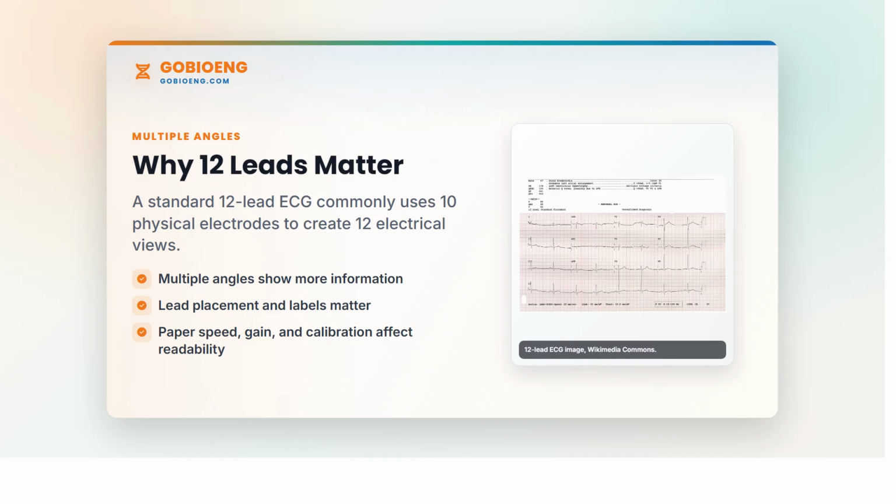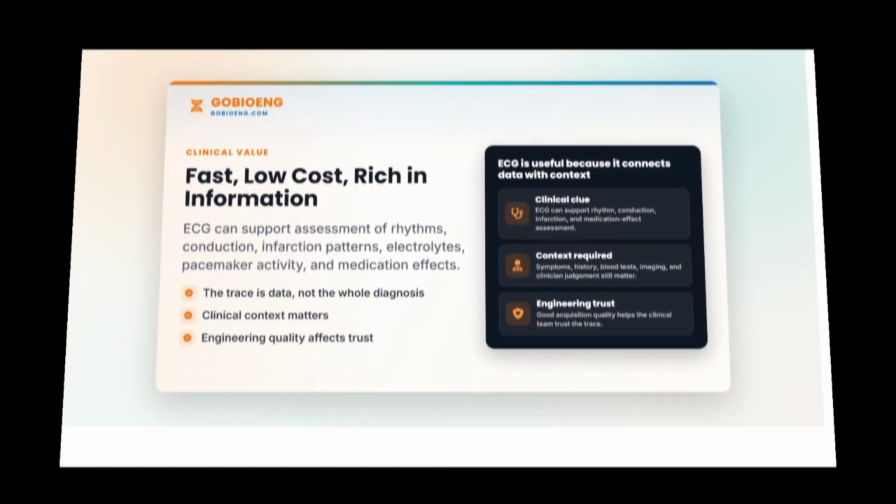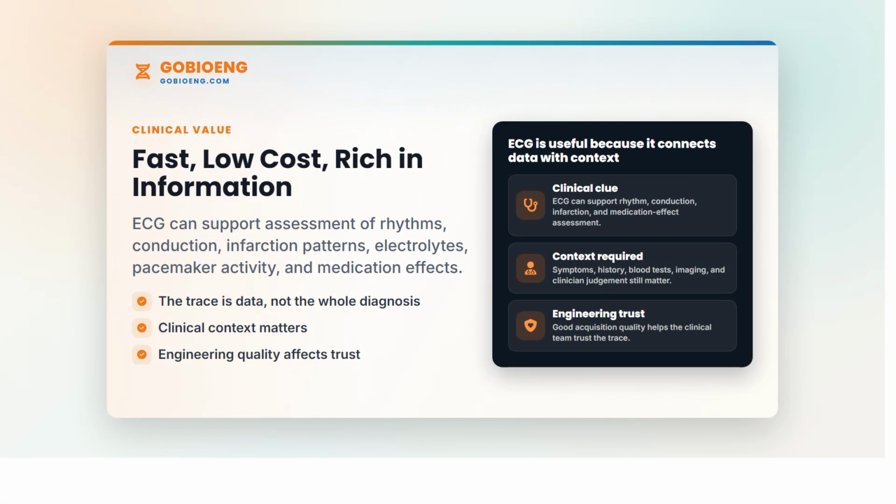Now let us look inside the ECG machine. The machine has to record very small biological signals in a noisy environment. The patient may move. Muscles may produce electrical activity. Electrodes may dry out. Cables may pick up interference. The device must also keep the patient safe from electrical hazards. The electrodes and gel create a measurement path between the body and the electronics. Poor skin contact can create artifact that looks serious.